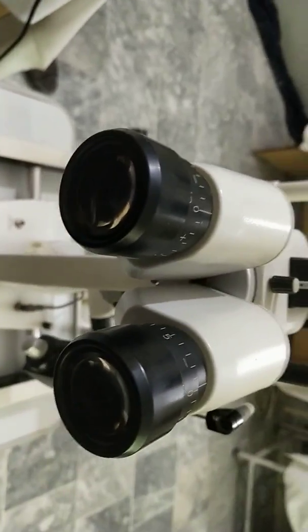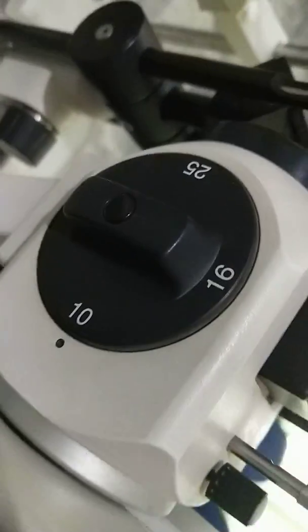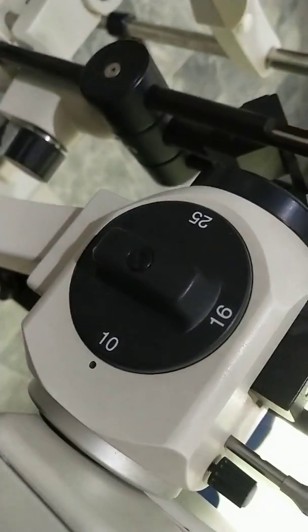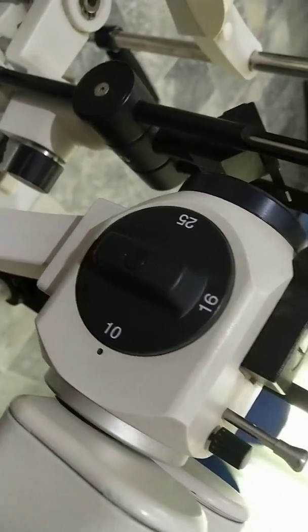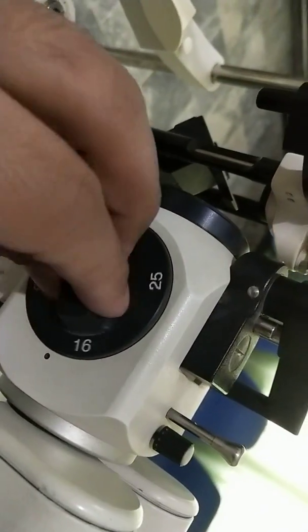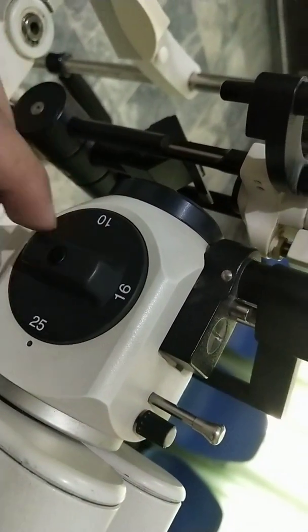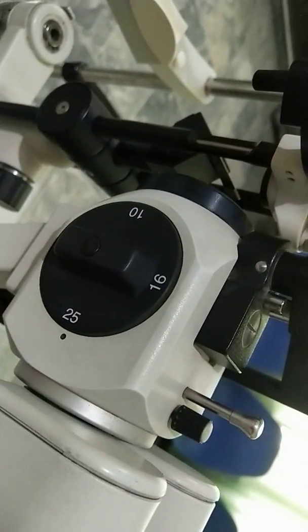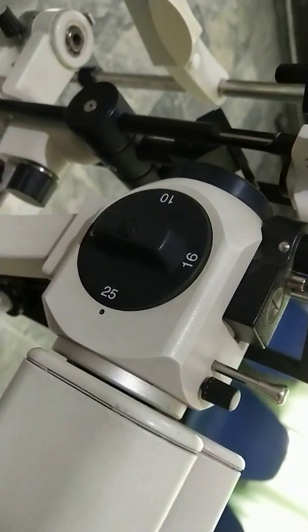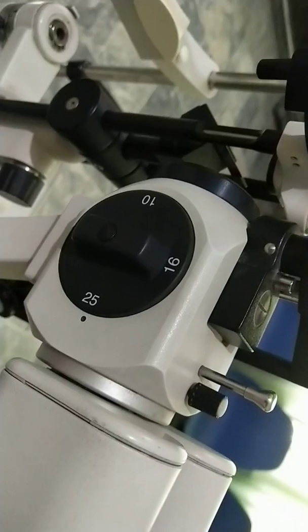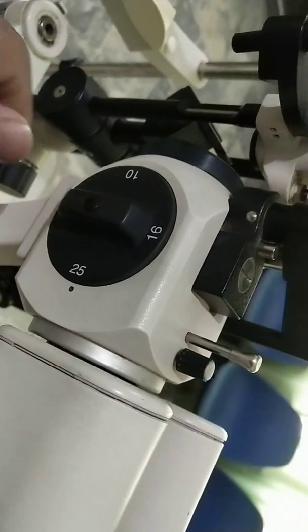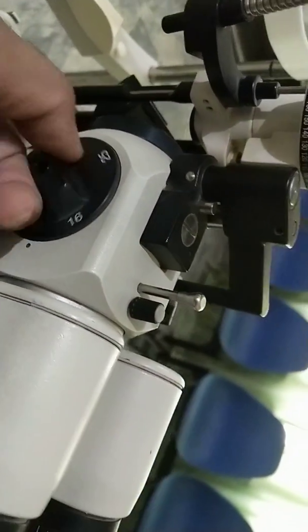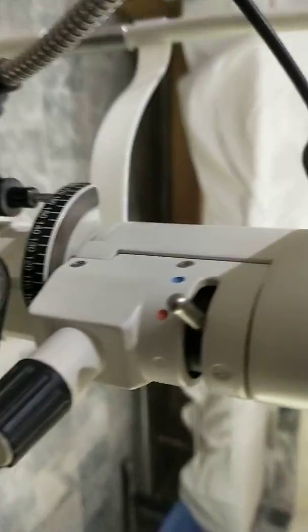Then here is the magnification. At the moment it is 10x, we can make it 16x, 25x for different types of examination like high magnification for cells in the anterior chamber.